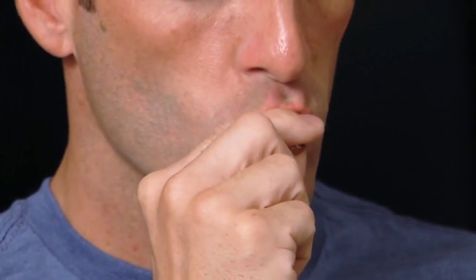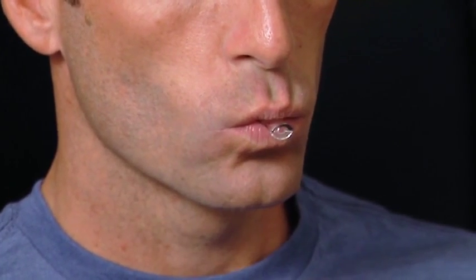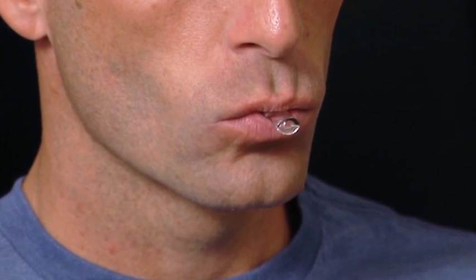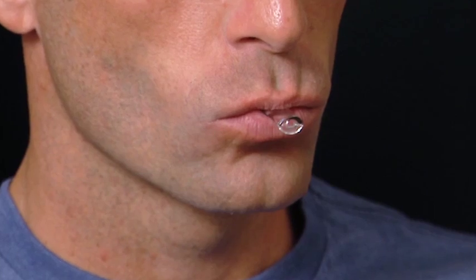Place the upper tray over your upper teeth. Bite down gently to check that your teeth fit within the flat surface of the tray. If not, you will need to narrow or widen the tray later in the fitting process.